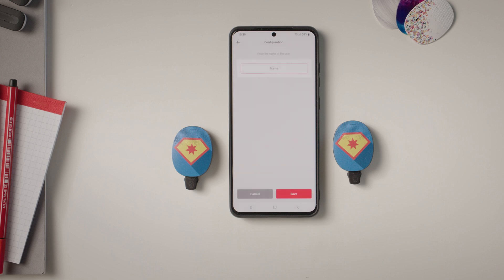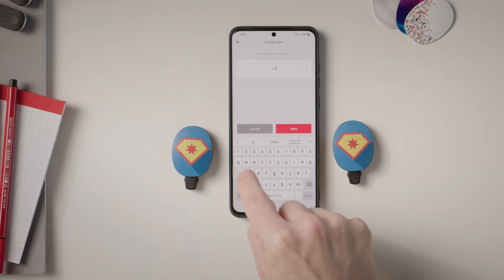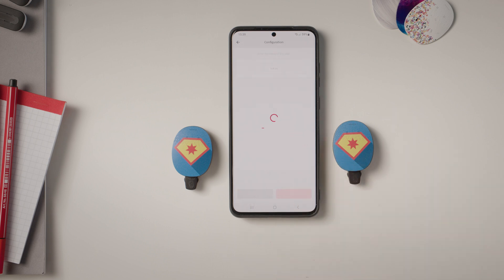Enter a user name with seven or fewer letters. Only letters from the Latin alphabet can be used. Then tap Save.